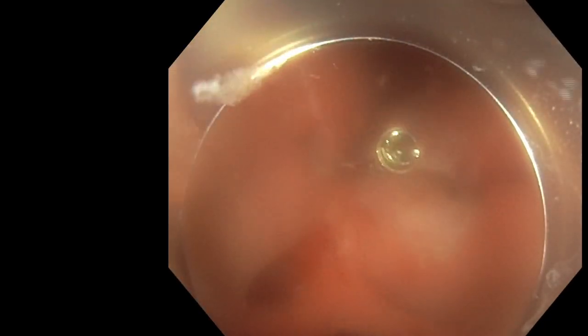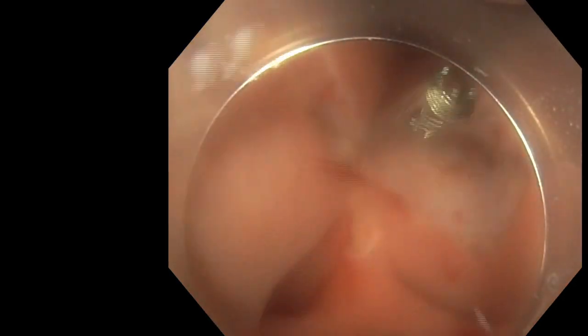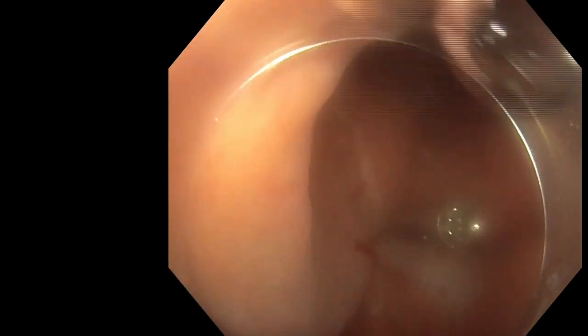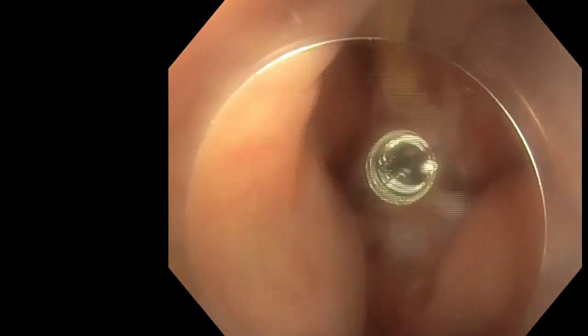Okay. So the area is closed, and we added, I think, 2 or 3 clips around this one to be sure of the complete closure.